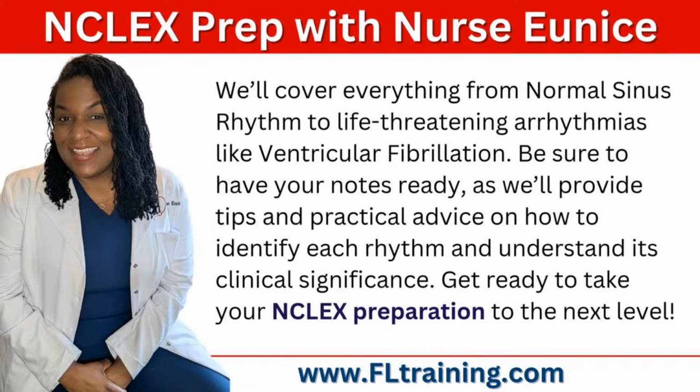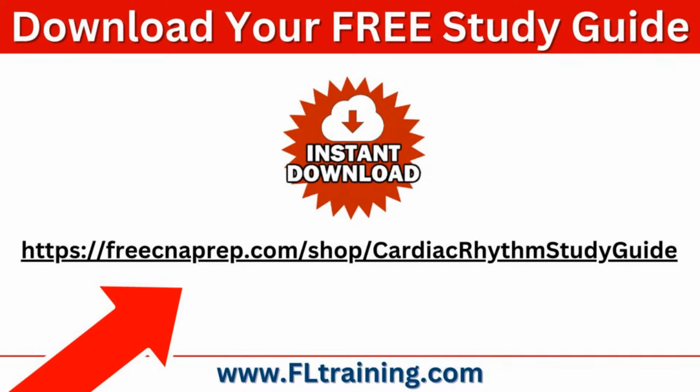So we'll cover everything from normal sinus rhythm to life-threatening arrhythmias, which is an abnormal rhythm, such as ventricular fibrillation. Be sure to have your notes ready as we'll provide tips and practical advice on how to identify each rhythm and understand its clinical significance. Get ready to take your NCLEX prep or your EKG knowledge to the next level.